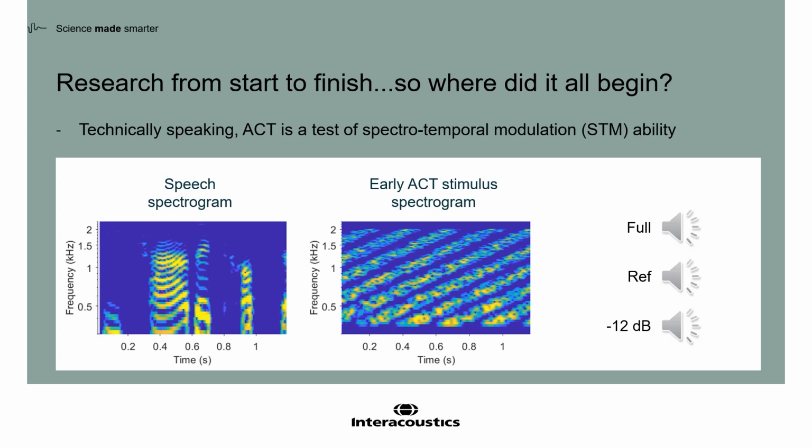First, you're going to hear the ACT stimulus. Next, you'll hear the reference noise or the steady noise. And finally, you'll hear the ACT stimulus imposed on top of the steady noise.